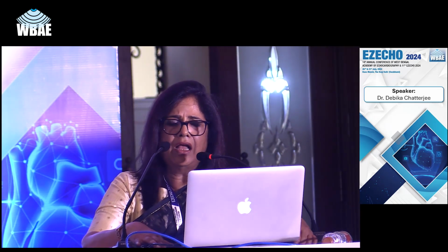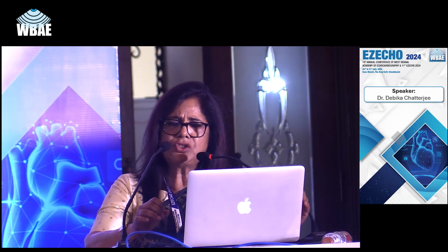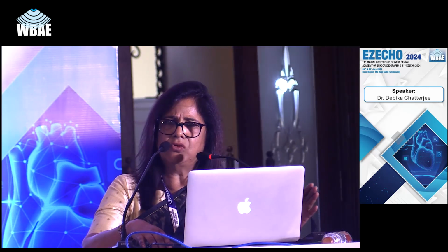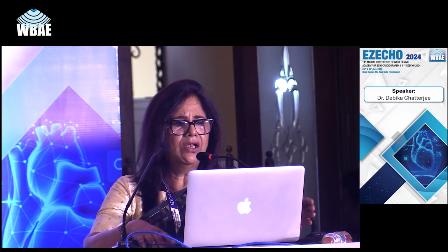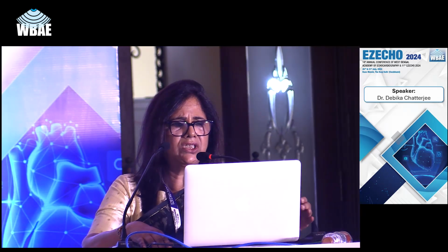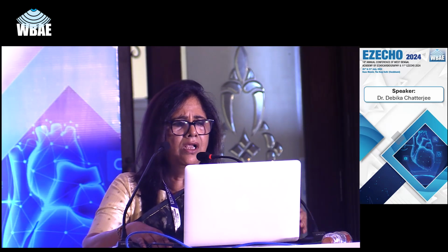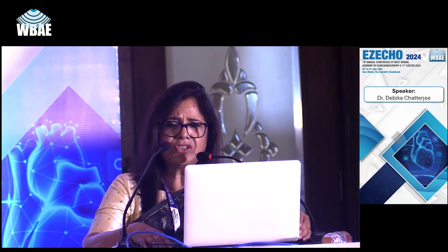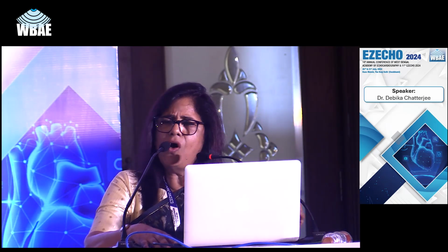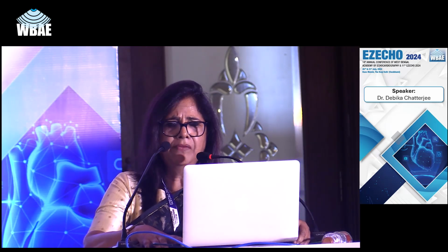2-dimensional echo and M mode both have various signs of hemodynamic derangement. Like when there is aortic regurgitation, we get fluttering of the mitral valve. In pulmonary hypertension, we get mid-systolic pulmonary valve closure. Dilated IVC indicates increased RA pressure. In cardiac tamponade, we get RA and RV collapse. But all these 2D and M mode signs are very non-specific.